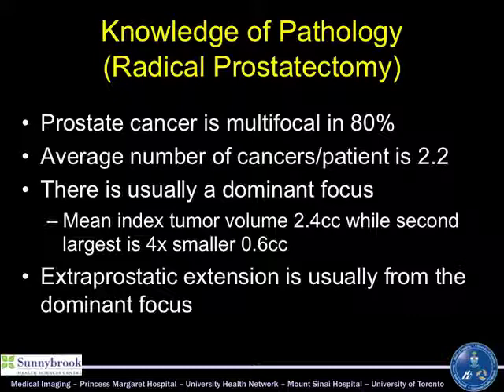And I actually hit this point about 5 years ago in the work where I said, I don't understand the radiologic pathologic correlation here. This isn't like renal cell where the tumors grow like nice balls. Something's going on. I'm seeing weird things, cases where I'm missing cancers. I don't know why. Cases where there's big cancers on pathology that I don't see at all on imaging. So I need to understand this better.